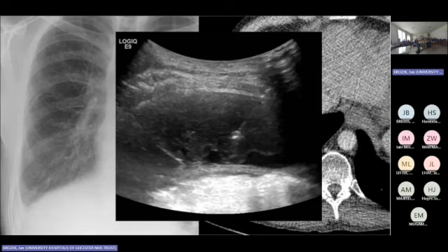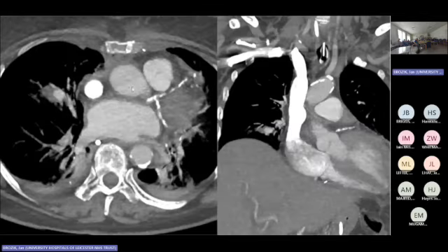The best way to use them is to review everything you have. Then you get the results. I met some clinicians who were very confident, I would say overconfident, with ultrasounds, who were even correcting CT reports. I equally met some radiologists who were really confident about CTs, and then you do ultrasound and it's a bit different. Yeah? So this is how it should be done.